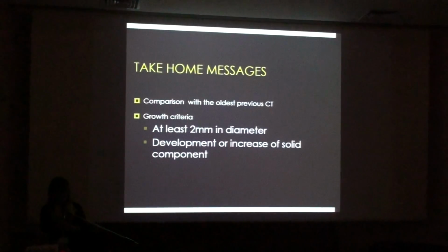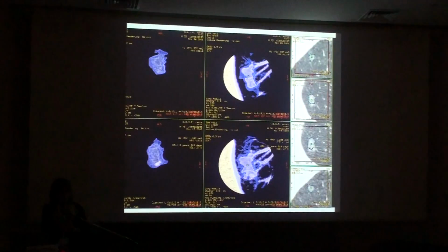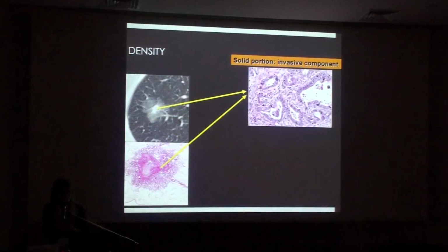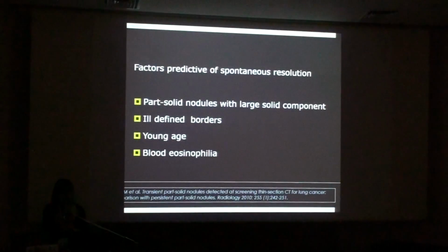No, it's not my personal opinion. It was just indicated in that paper from, I don't remember the author, Dr. Lee, but he mainly recommended to perform the CT follow-up. So there are no strong criteria allowing to avoid performing a follow-up CT. But maybe it's to tell the patient not to worry while waiting for the follow-up CT.